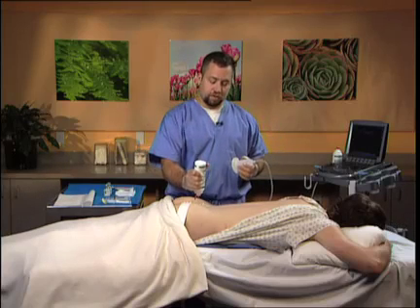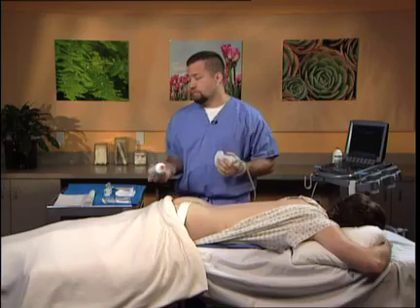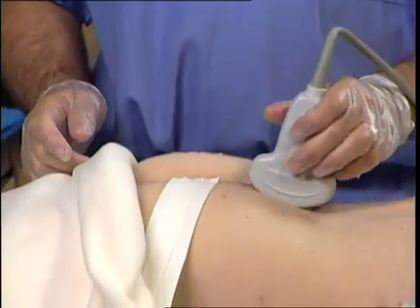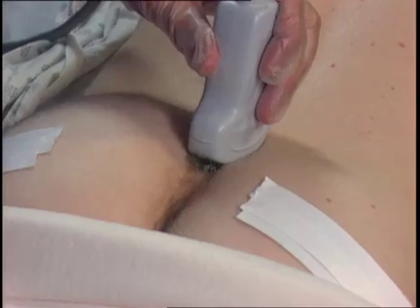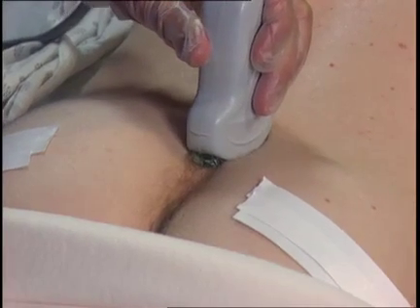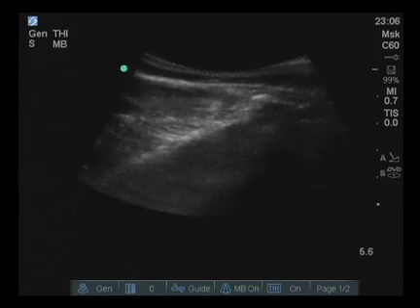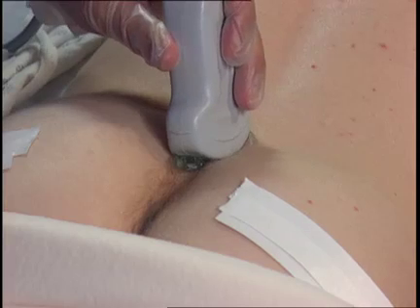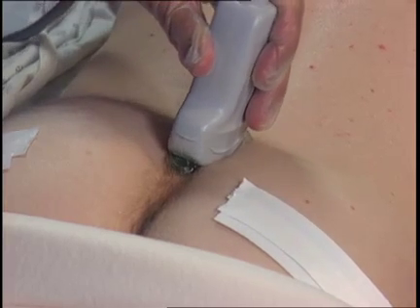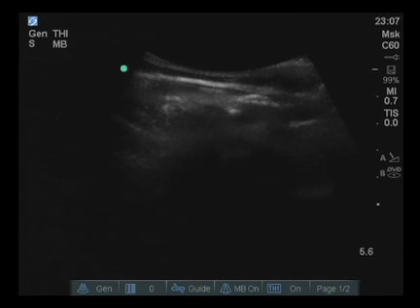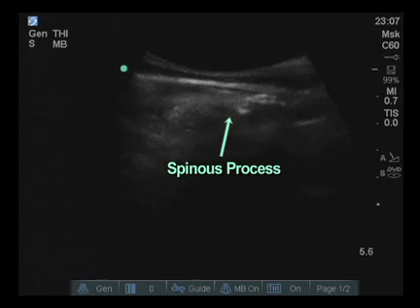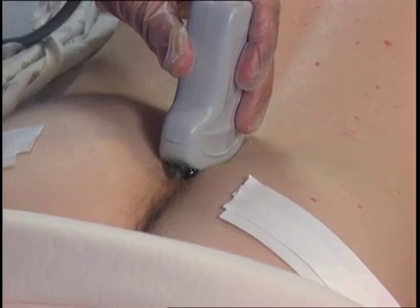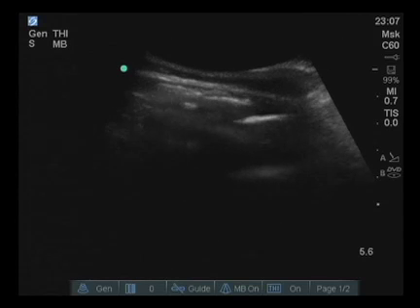Placement of a copious amount of gel for aqueous coupling is important to enhance resolution on the screen. Contact is made in the midline. Because there is anatomic variation in the midline physiologically, a sagittal view and then gently rocking the probe in the oblique direction can help find the spinous processes of the sacral space. The probe is then moved caudally, and very clearly the sacral hiatus comes into view.